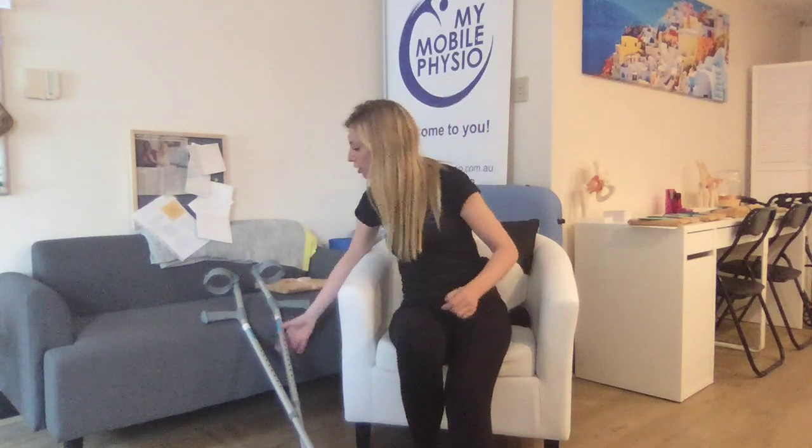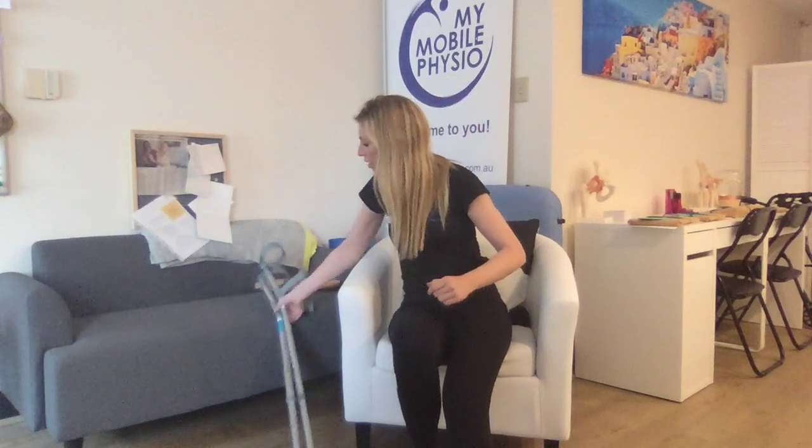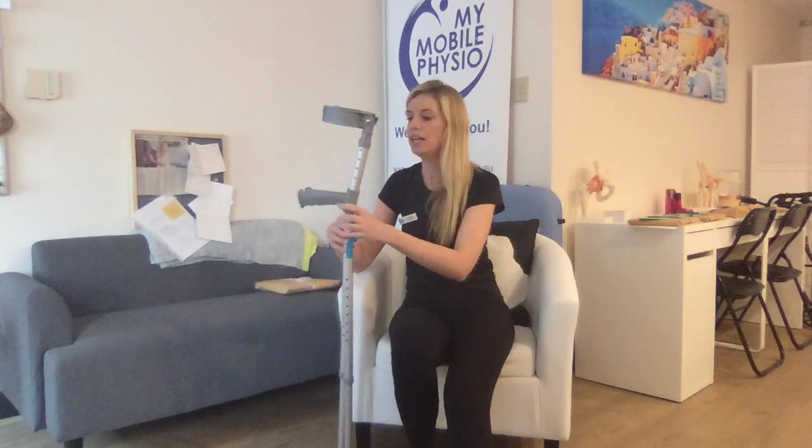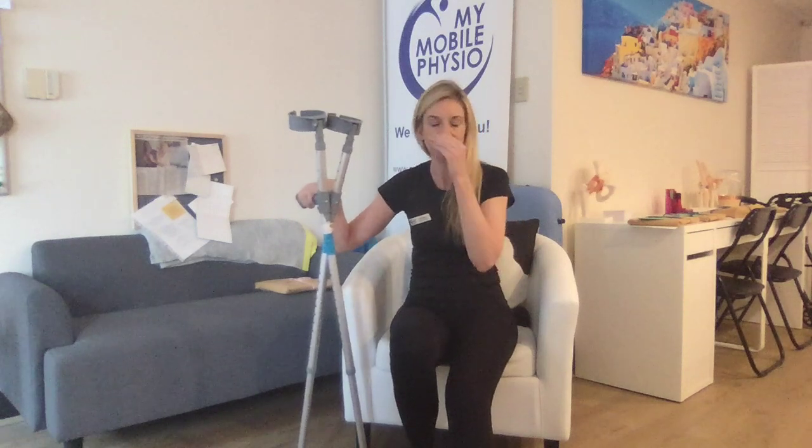You then want to take your crutches and put them in the opposite hand to your operated leg. You're then going to use your other arm to push up from the chair, and you'll have your crutches there to give you some support as well.